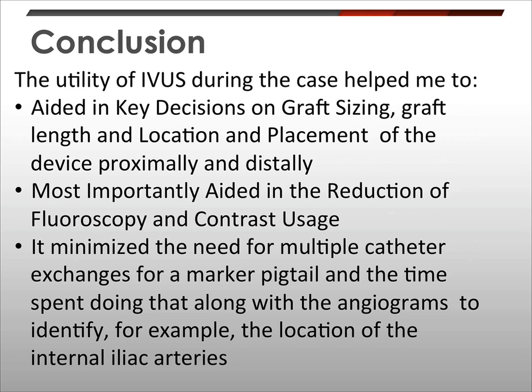It minimized the need for multiple catheter exchanges for a pigtail marker and all the time spent doing that, along with the additional angiograms to identify, for example, the location of the internal iliac arteries.